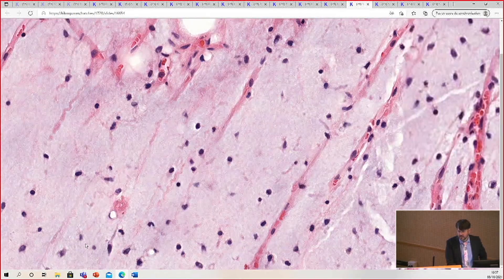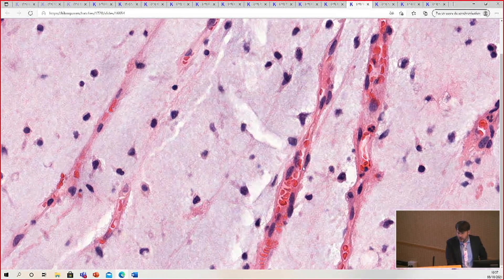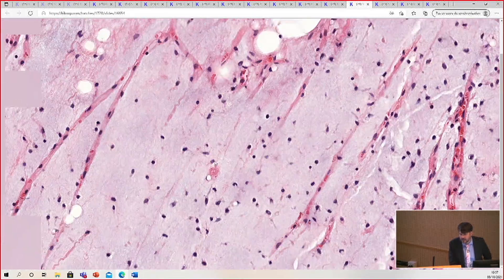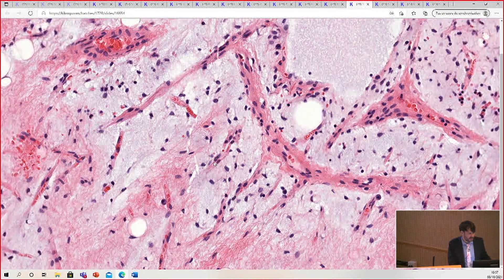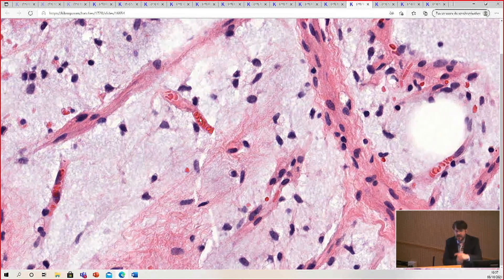These are the vessels of myxoid liposarcoma. It's like one endothelial cell — that's the vessel wall. One endothelial cell. The vessel lumen is only big enough for cells to go single file, almost like a rouleau formation in myeloma where cells stack up. It's one endothelial cell at a time, single file. That's how small the vessel should be in a myxoid liposarcoma.